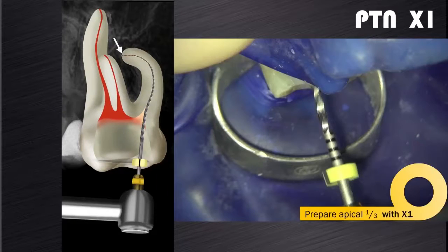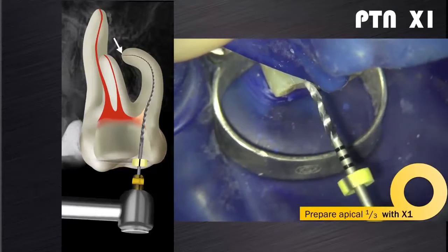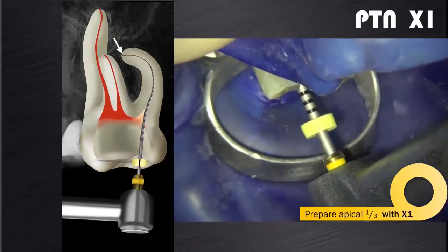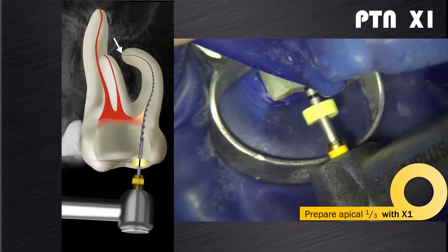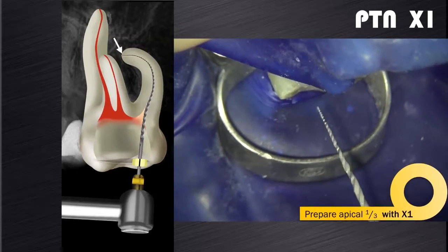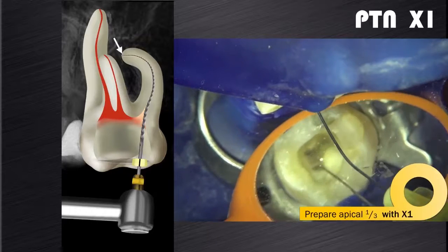If you now go back to the ProTaper Next X1 after you've cleaned its cutting flutes, you will find that the X1 will progress very easily to full working length without any strain on the instrument while it prepares the apical third of the canal. I find this protocol a much safer way to introduce ProTaper Next instruments when I'm faced with complex anatomy. This is again followed with an irrigation, recapitulation and re-irrigation cycle.